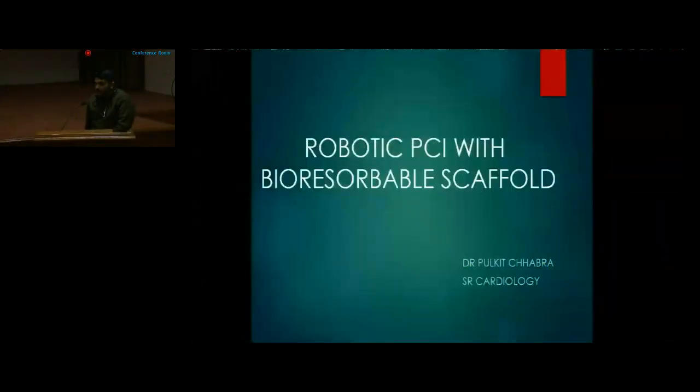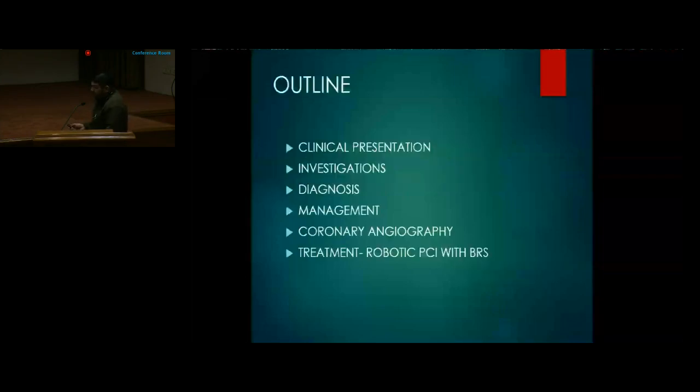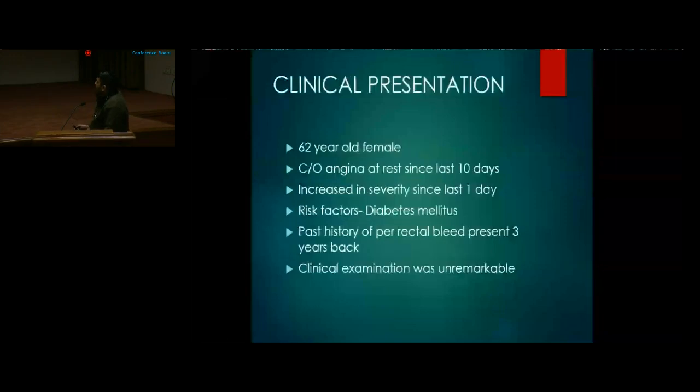I am Dr. Pulkit, SR Cardiology. I am presenting today the second case. It is robotic PCI with BIORESORBABLE scaffold. So this will be the outline of the case.